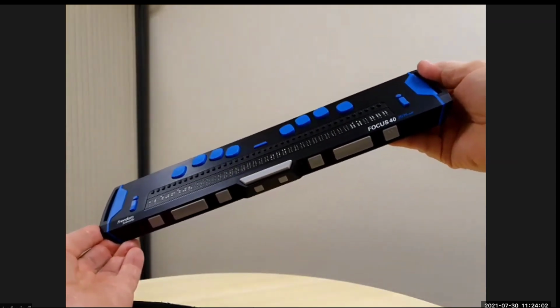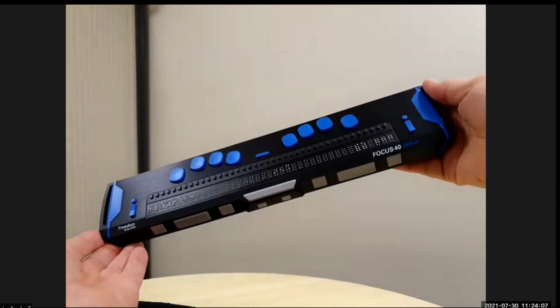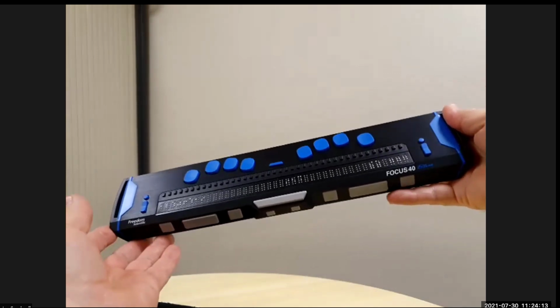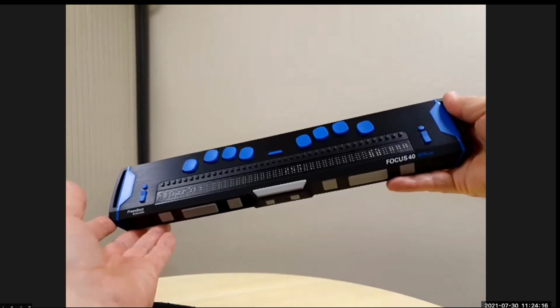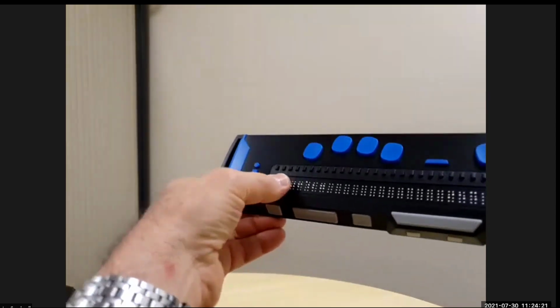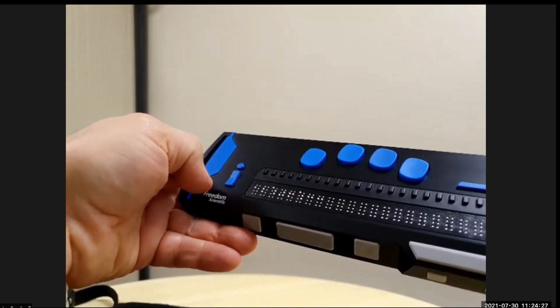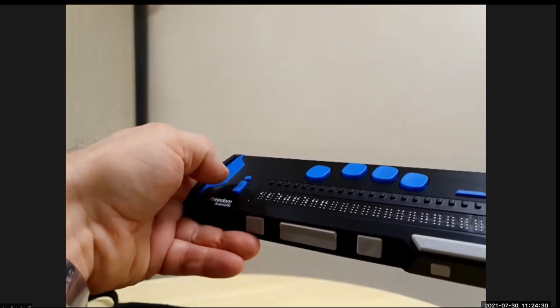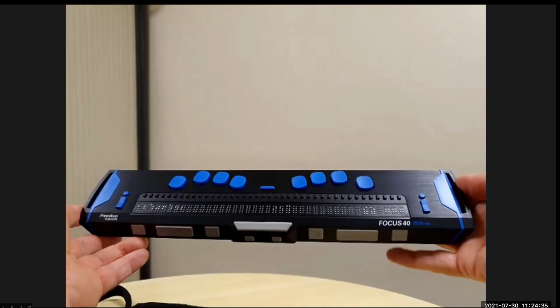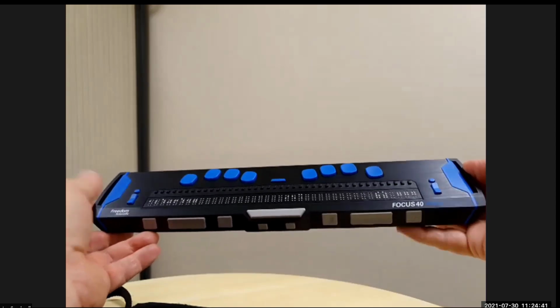So the Focus 40 is a 40-cell Braille display. Now, what do I mean by that? When you're dealing with Braille in general, a character is classified as what is called a cell. So the Focus 40 has 40 cells of Braille, and that's a standard sort of Perkins Braille width if you use the wide paper. So the display is slightly wider than 40 cells. It'd be a very similar width to a Perkins Braille, for those of you who've seen one, because there are controls at either end of the Braille display itself.